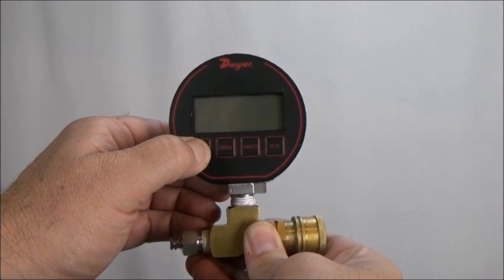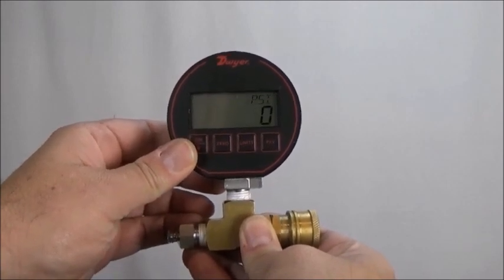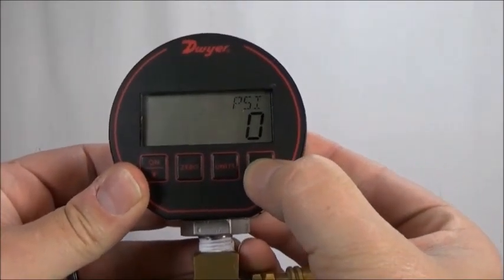Turn the digital pressure gauge on and cycle the display to read peak pressure. Ensure it currently reads 0 or 1 psi. If it does not, turn it off, then back on again.